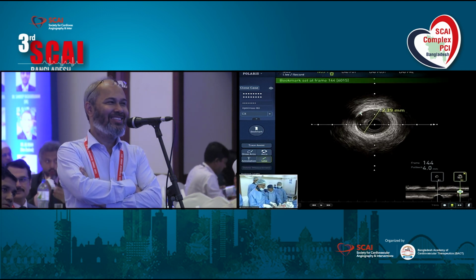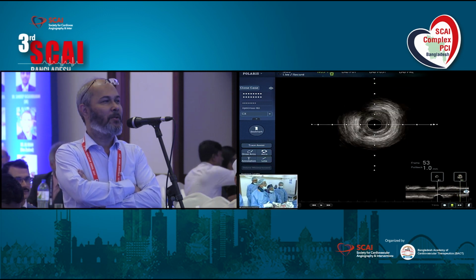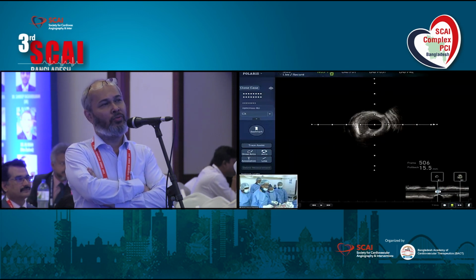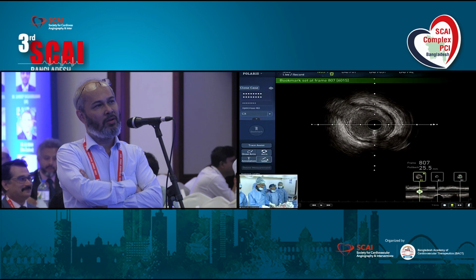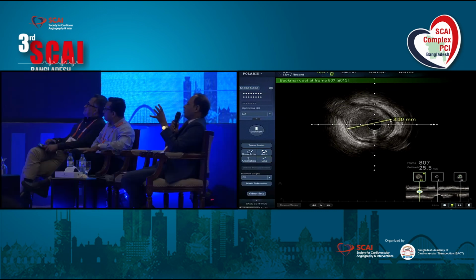So is there any IVUS criteria for dissection to leave it alone? What do you think, Ramesh, in that particular situation? It was told by Dr. Antonio Colombo, put the pressure wire and see. No, IVUS criteria for dissection to leave it alone, not angiographic, not pressure wire.